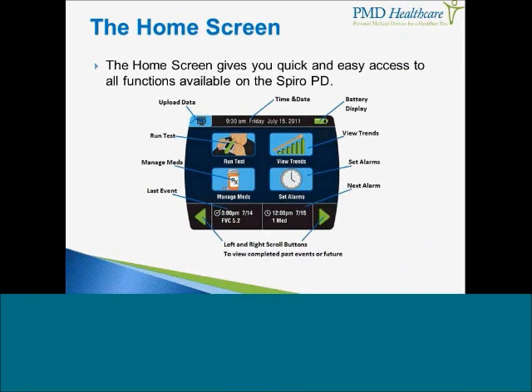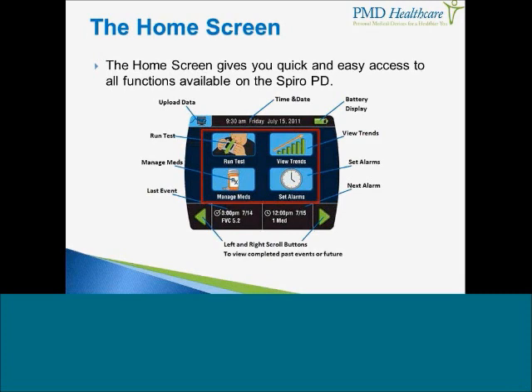This is what the home screen looks like. Everything that you need to do with SpiroPD — all the functions — are available on the home screen. At the top left you have your upload data button, which is what you'll click when you want to upload your data to the computer or send an email to your doctor. You also have your time and date and battery display. The middle section includes your run test button, manage medications key, view trend button, and the button to set alarms. In the bottom section you can see the left and right scroll buttons, which you'll use to view completed past events and also future events.